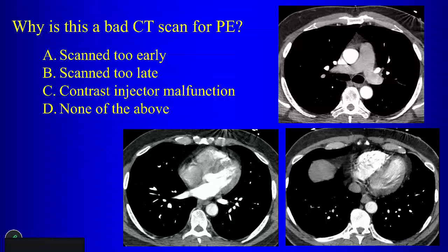So what happens if a patient takes a deep breath right before you start? The contrast goes in, we're ready to scan. Either the instructions weren't set right, or the patient takes a deep breath right before the scan. What goes wrong? IVC mix. Does the blood from the IVC go? Yeah, you have the IVC blood.